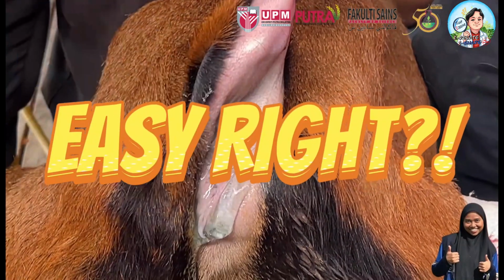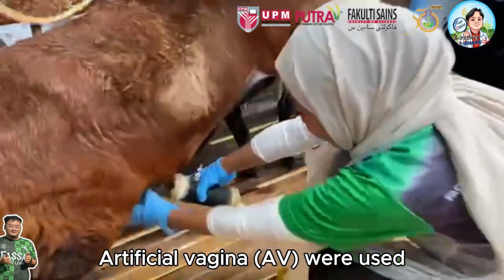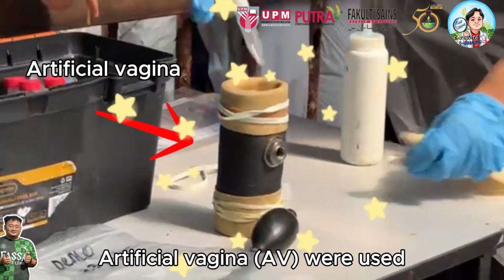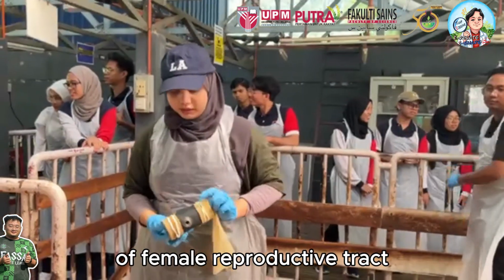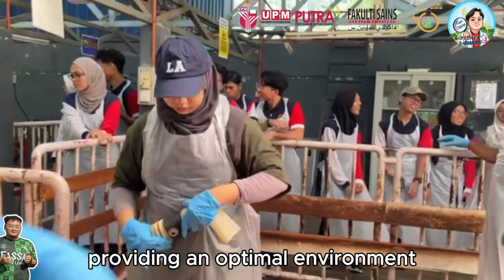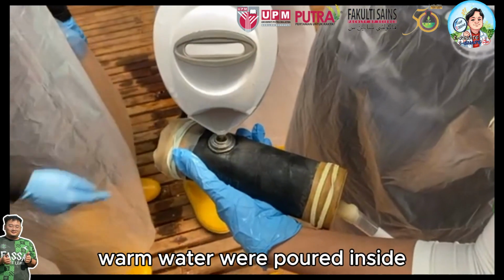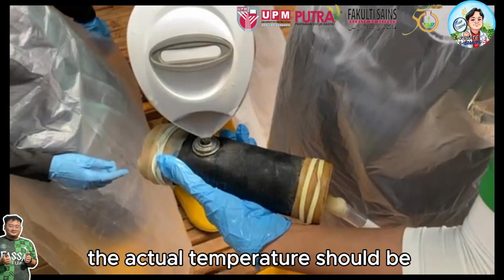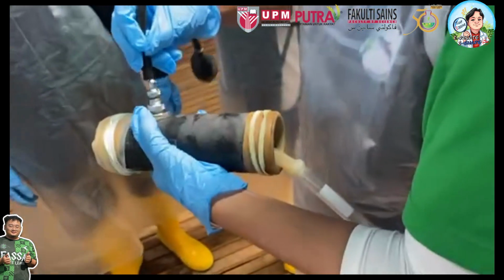Easy, right? Semen collection. For semen collection, an artificial vagina was used. It is designed to mimic the natural condition of a female reproductive tract, providing an optimal environment for ejaculation. Warm water was poured inside to mimic the temperature. The actual temperature should be around 38.5 Celsius.